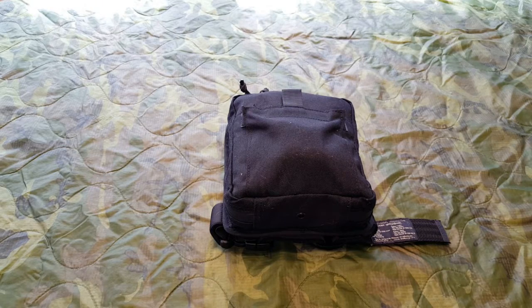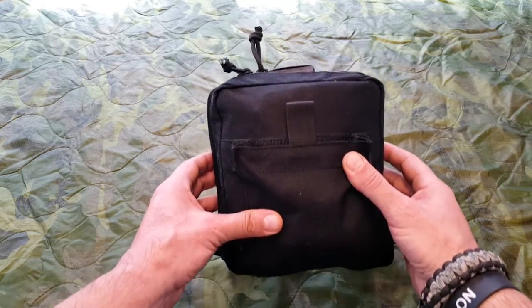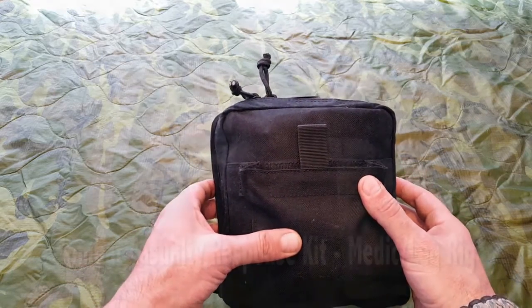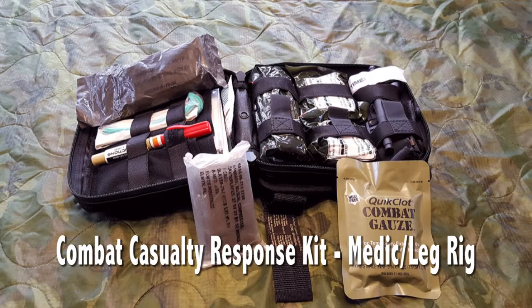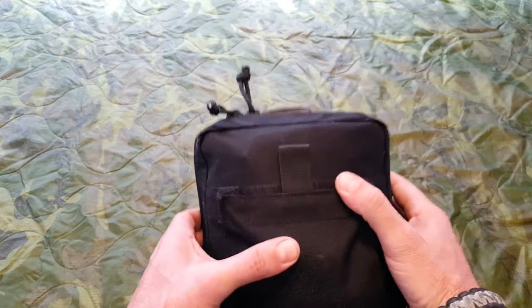Hello everyone, Helger here. Today I wanted to talk about this Medic kit. It's known as a Medic Leg Rig Kit or a CCRK, which is Combat Casualty Response Kit, made from a company called North American Rescue. Very respected in the first responder community. This is a very high quality kit.